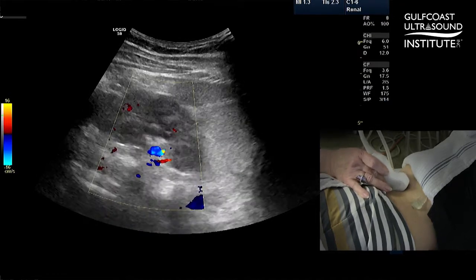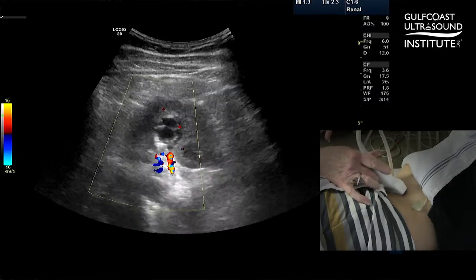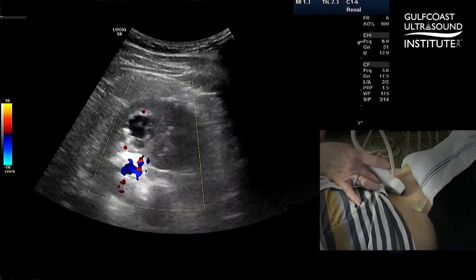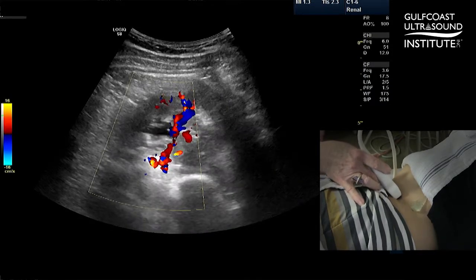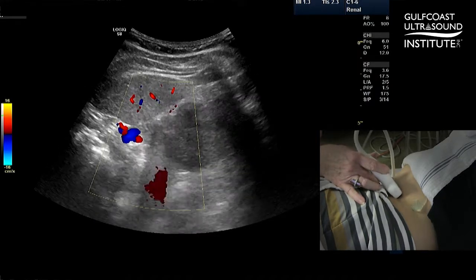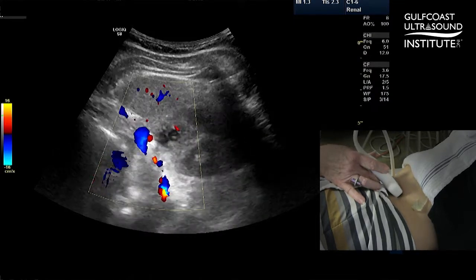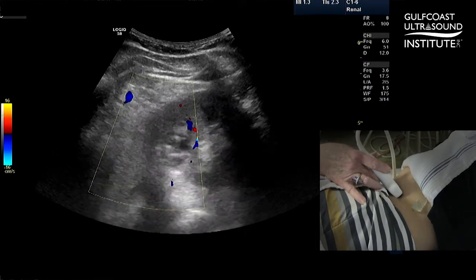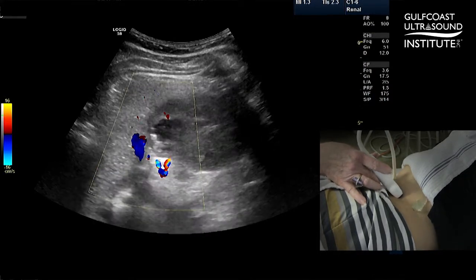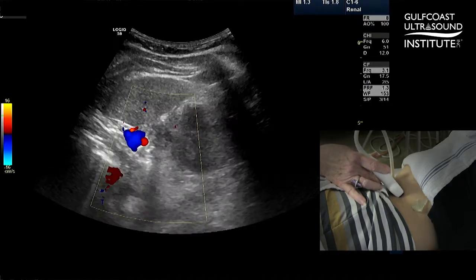Now, if that position doesn't work, I can rotate the probe a little more so that we bring the renal artery out of the renal hilum at closer to the 7 o'clock position. That means the renal artery is going to curve just slightly in most patients toward the spleen. It takes a slight S-shaped curve in the mid-segment, and I'm fanning in and out of the kidney so you can see that little bit of curvature.